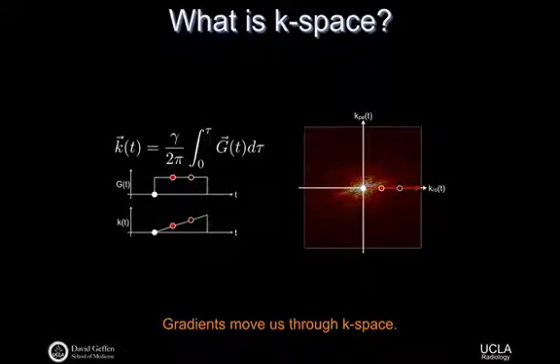So I want to introduce the concept of k-space. You've heard it some, you've maybe seen it in another class, and I want to give you one piece to hold on to for today. We're going to talk a lot about k-space over the next at least four or maybe five lectures even. Of course, it's fundamental to understanding MR.